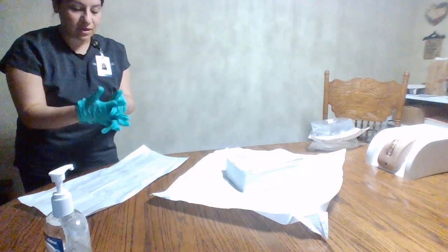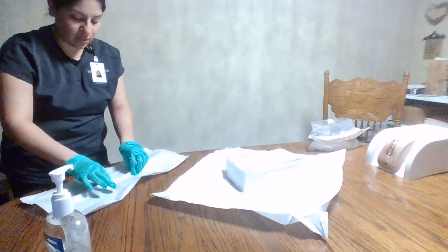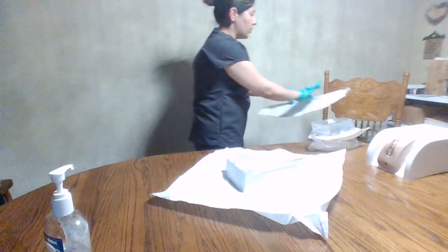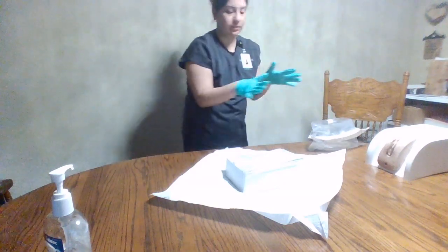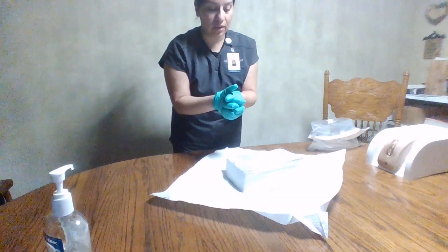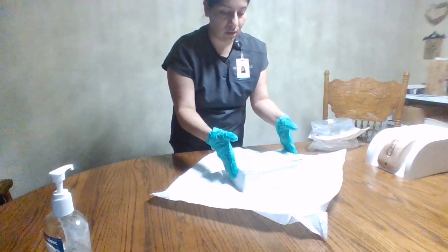And once I have placed on my sterile gloves, I will go ahead and get rid of the packaging since it is no longer needed. And I will go ahead and place that in the trash. Okay. And then I will go ahead and set up my Foley kit.